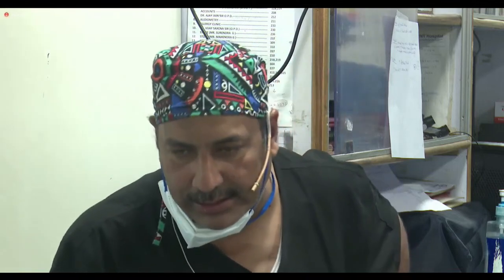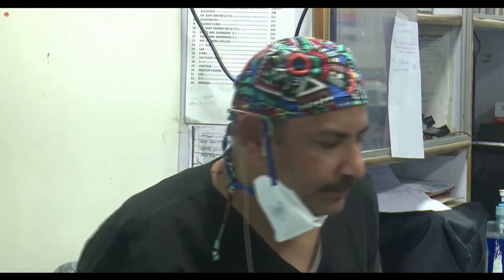The facialization is when the anterior wall is eroded: remove whatever is left of the anterior wall and remove all sinus mucosa, drill away until normal bone, block the frontal recess outflow, and allow the front outside skin to fall upon the posterior wall. It may give a defect which you can reconstruct with bone cement. That is successful provided you don't leave any mucosa buried underneath. So the first foremost thing is the mucosa removal. Complete radical removal of the mucosa is the priority before doing anything such.